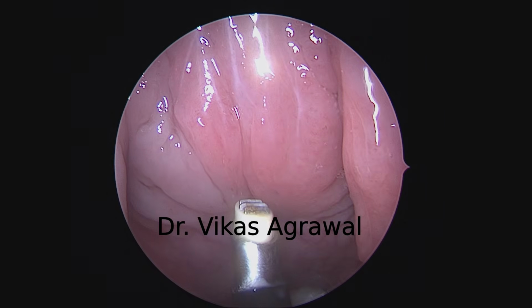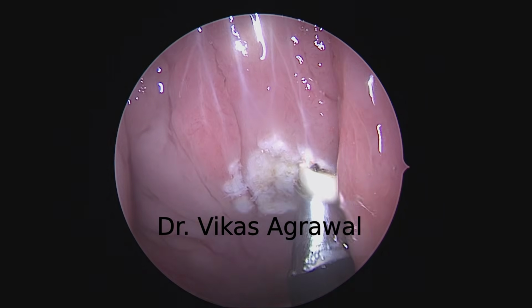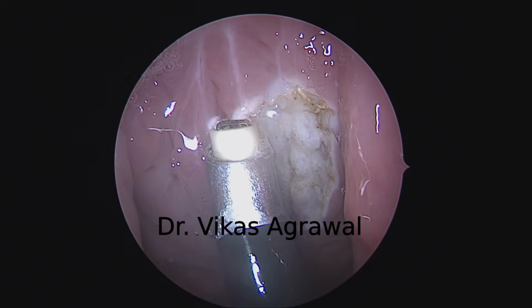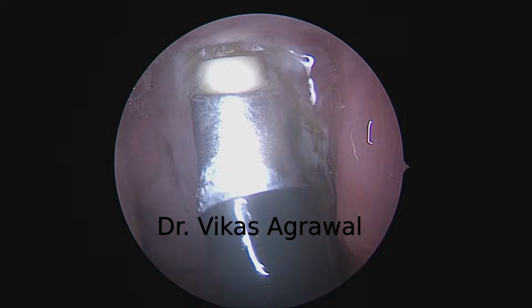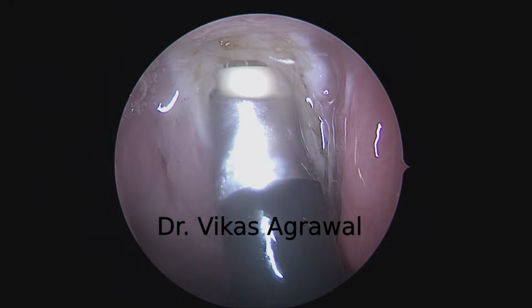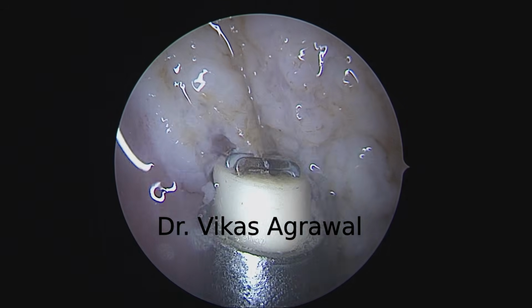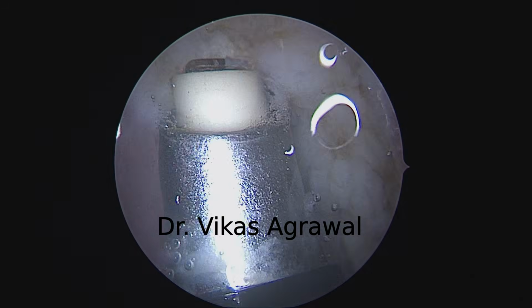So I am removing the lymphoid tissue from the posterior boundary of the adenoid, posterior and lateral. Let me first do the first layer. This is the superior boundary, the periosteum below the sphenoid bone. As you go in deeper over here, you'll see the posterior boundary, which is the buccopharyngeal fascia, in a moment.